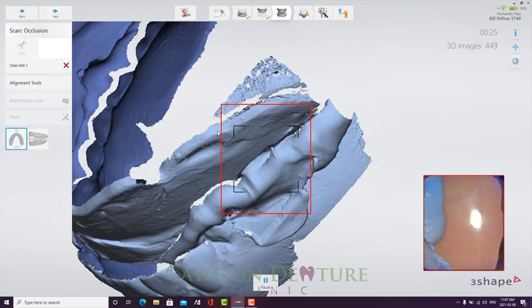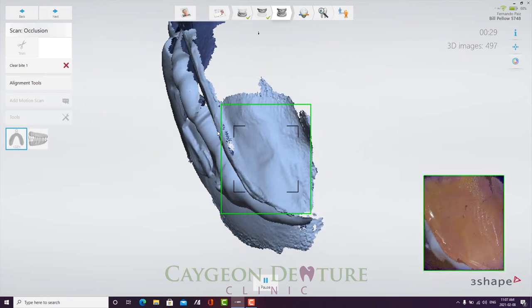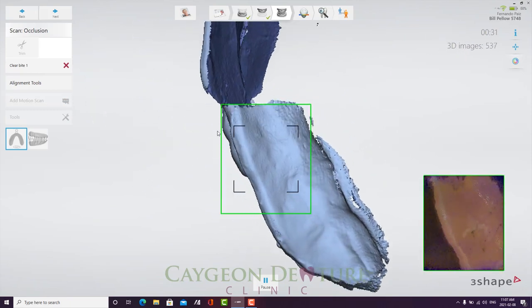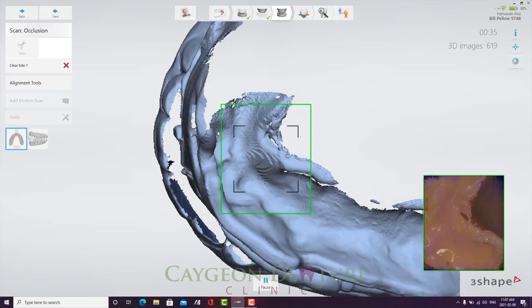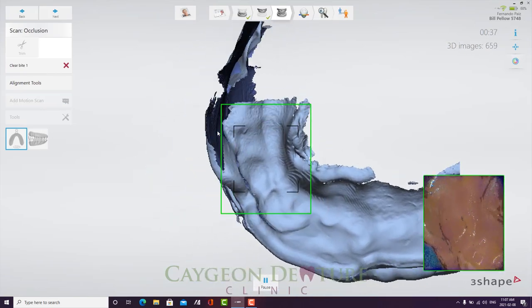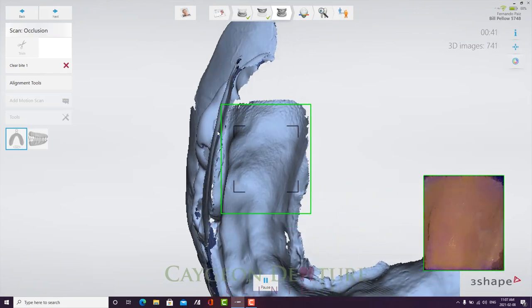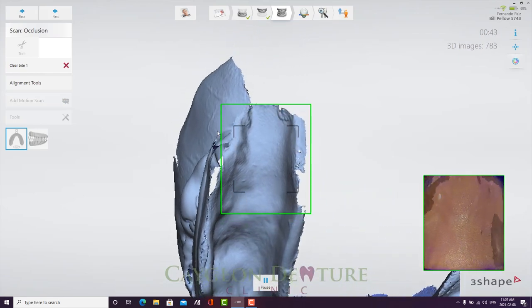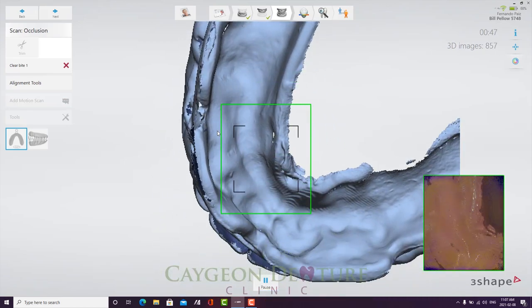So in order to align the bite, it is important to scan the facial and buccal aspects of the complete upper denture, and the same for the bite rim. But for the bite rim, you also need to scan the intaglio surface, as that is what you're going to use in order to align it to the lower edentulous scan.